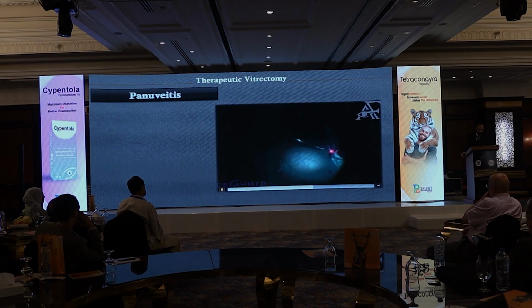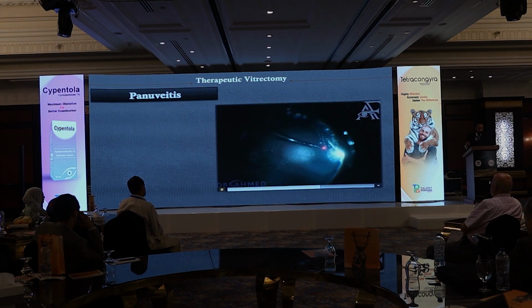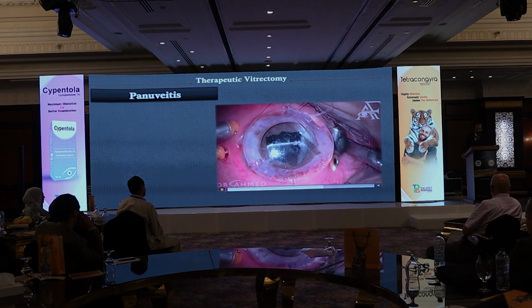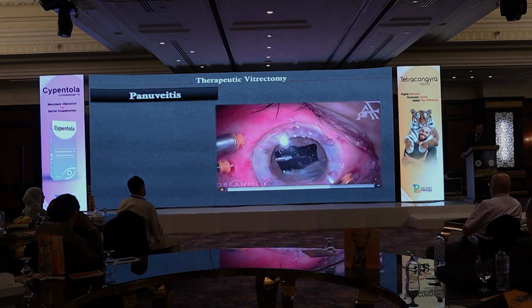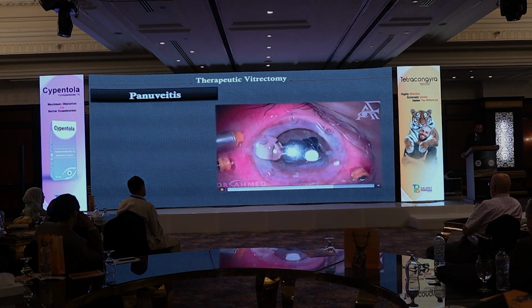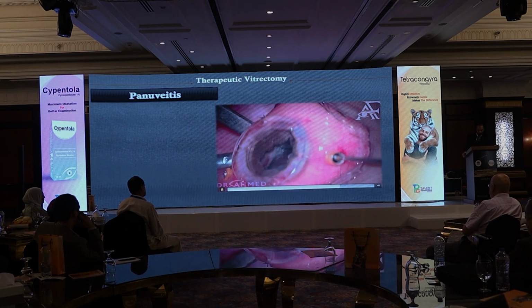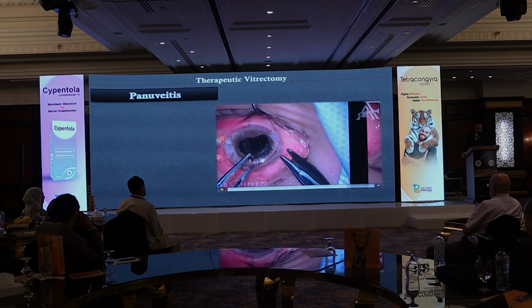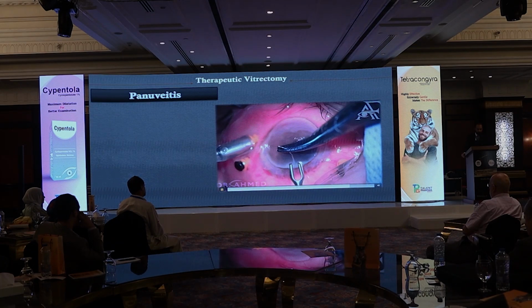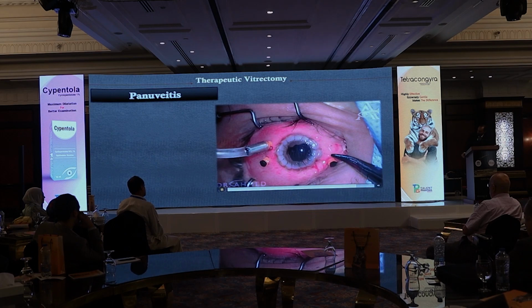Of course, after meticulous vitrectomy, you can cause some iatrogenic tears, especially in the periphery, which will be very weak in endophthalmitis. We did laser, again removing the membrane around the ciliary body, trying to protect the ciliary body as much as we can. But you can see this ciliary body is diseased in this patient. It was affected because she had like 2 keratoplasty surgeries. And we removed the keratoprosthesis, and we went for keratoplasty afterwards.